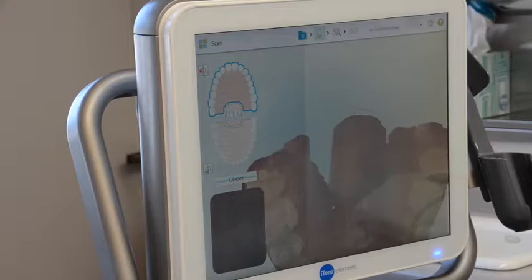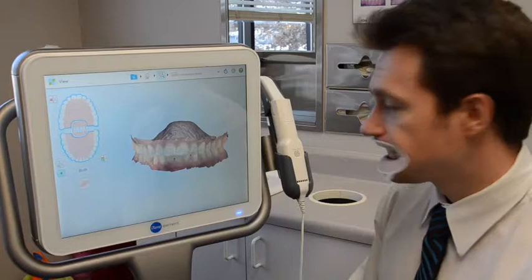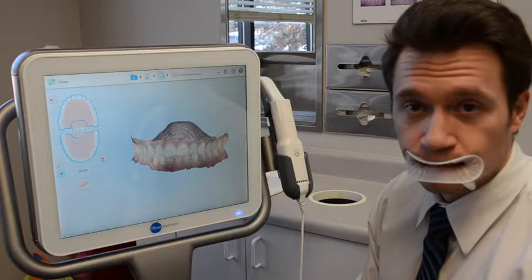So after the scan, here is our fully digital model of all the teeth that Shayla so nicely scanned. From here, we would simply just send the digital file off to either Invisalign or one of our local labs that we work with. And that's really it.